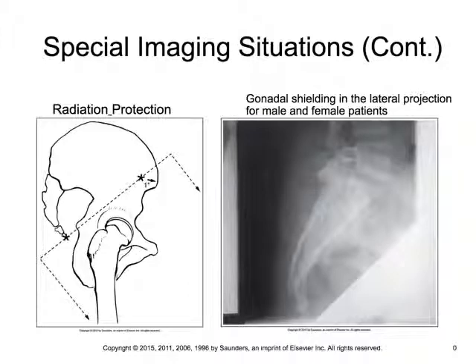It's probably just a lead strip over this image. They didn't want to change the collimator angle because they wanted to make sure that they had adequate penetration of the part and that they were able to visualize all of L5. So rather than turn the collimator, they just applied a lead shield to the area that they're trying to avoid exposing to radiation.